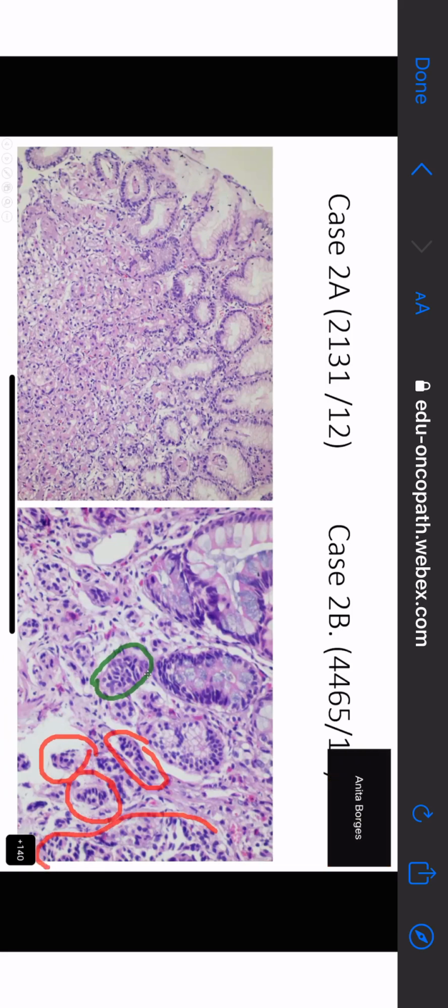Very good. Sweta, did you see the nests? Yes, ma'am. Oh, you did. So why did you not say that there were nests, Sweta? So Dia sees nests. Vimi, did you see the nests? Yes, ma'am. Yes, you did. Not only that, you can see these nests prominently at the surrounding, some of these mucinous glands of the gastric antrum.